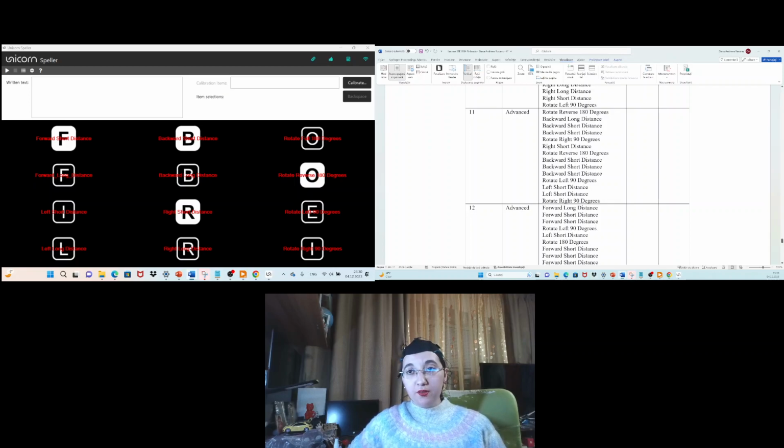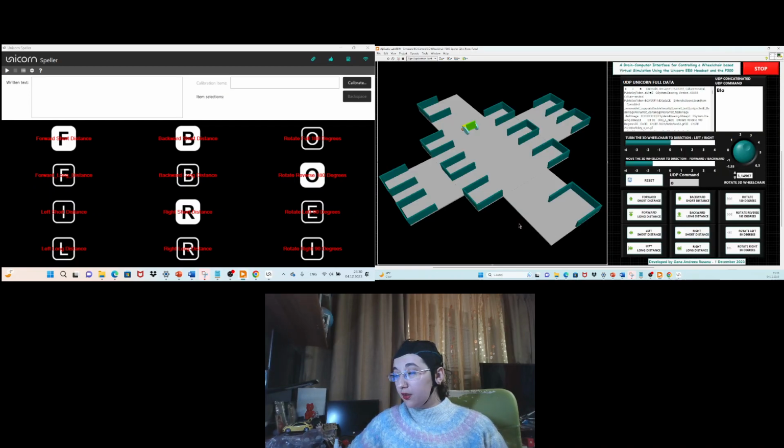So all the commands are related to movement directions for controlling the 3D wheelchair. This is the initialization, the starting position. So the 3D wheelchair should be controlled by different movement directions to reach these destinations.